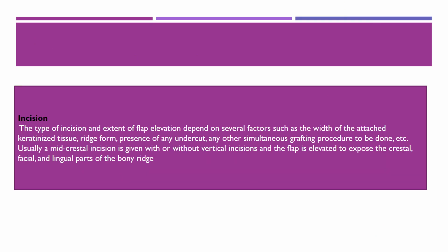So coming to the surgical part, incision. The type of incision and the extent of flap elevation depend on several factors. So according to the width of attached gingiva, keratinized tissue, ridge form, presence of undercut, or any simultaneous grafting procedure to be done, etc. It is used as a mid-crestal incision is given with or without vertical incision.